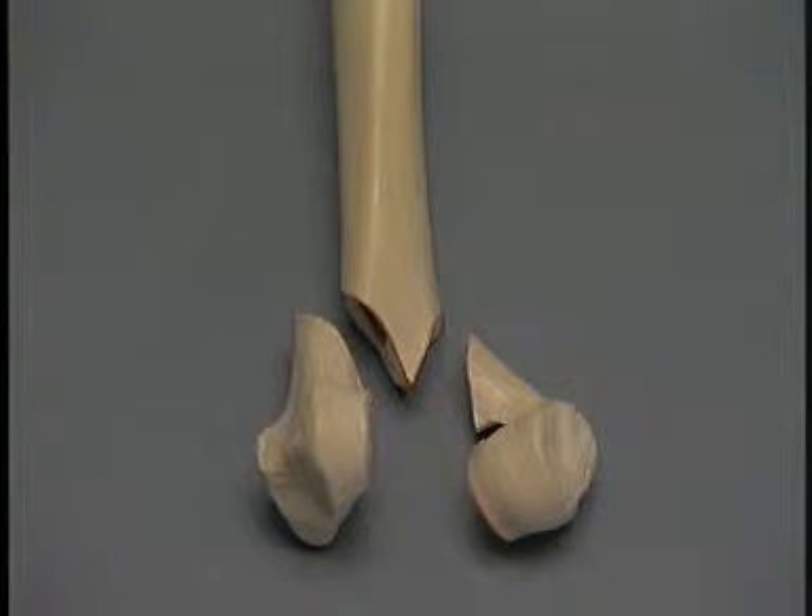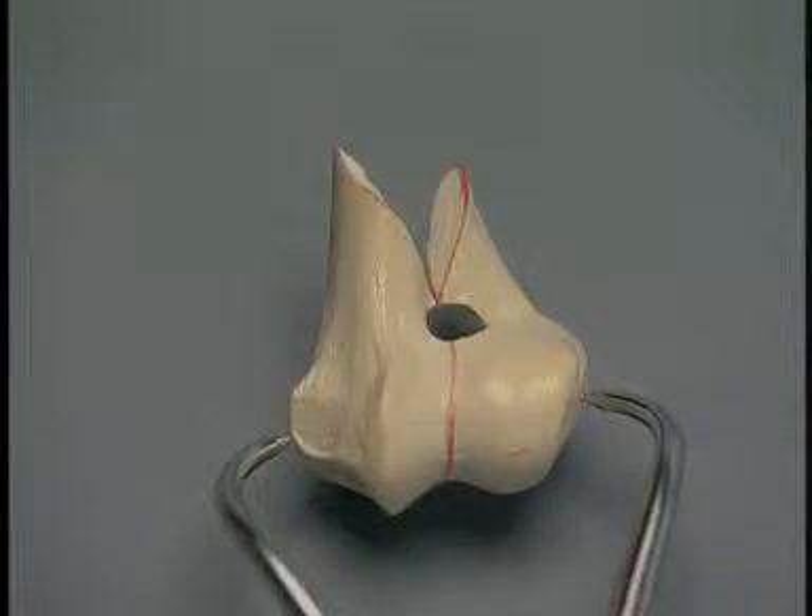A Y fracture of the distal humerus is shown. When presented with a three-piece fracture, a start is made by reducing two fragments anatomically. Often surgeons choose to reduce the condylar portion of the fracture first. This is accomplished by placing an intercondylar lag screw in the two distal fragments.